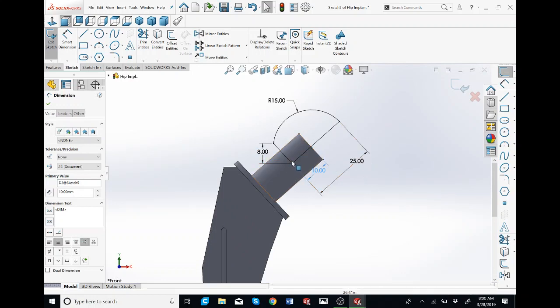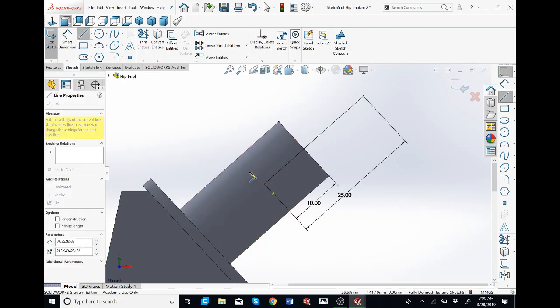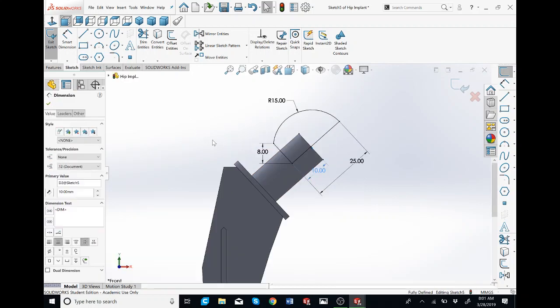Now I have another line going this way to make it perpendicular to this line, and a 3-point arc. So I'm going to go back, make a line, click on this point. You can see the white box showing it's perpendicular. I'm just going to click on that. Press escape. I'm just going to check the dimensions real quick again. It's 8.